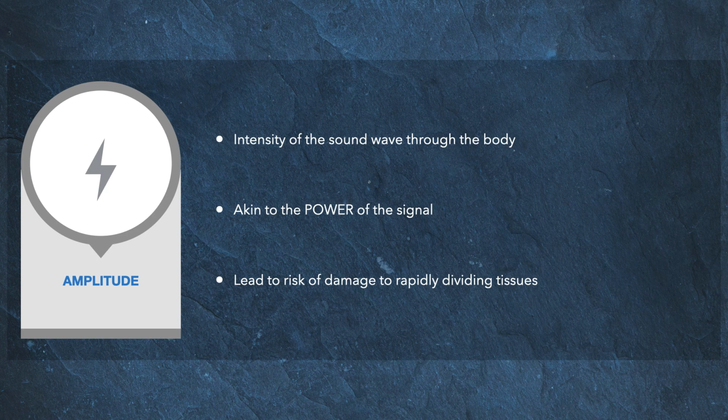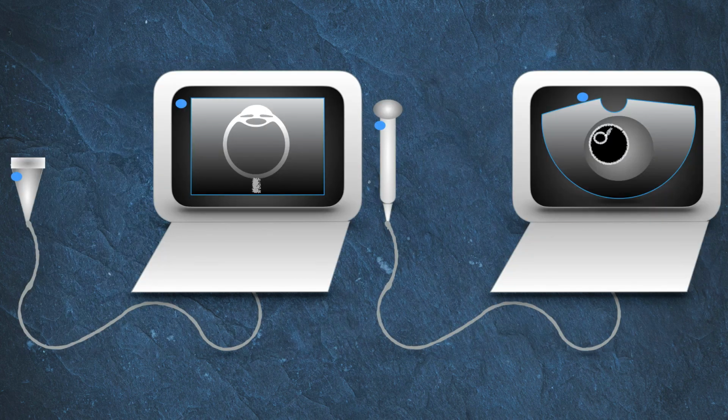As mentioned previously, your ultrasound machine comes with specific presets for each image type. As such, so long as you are using the appropriate setting for the machine, you should also be following the principle of ALARA. This is most pertinent in pregnancy and ocular ultrasound. In general, we do not use color Doppler in pregnancy in POCUS due to increased power generated by the signal and the theoretical risk to the developing fetus. Ocular ultrasound is the other exam for which the power of the signal should be considered carefully.